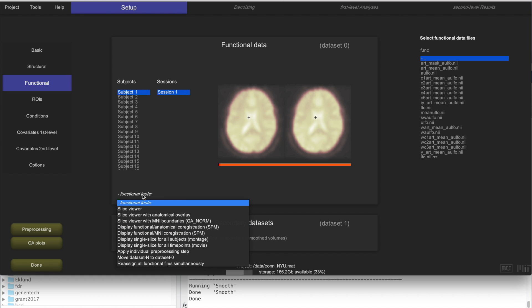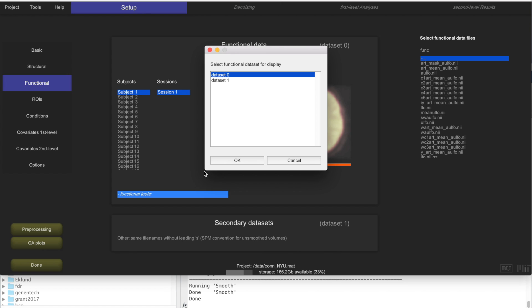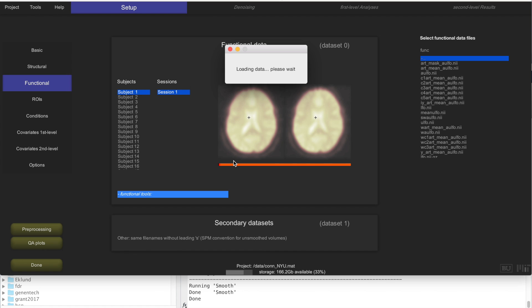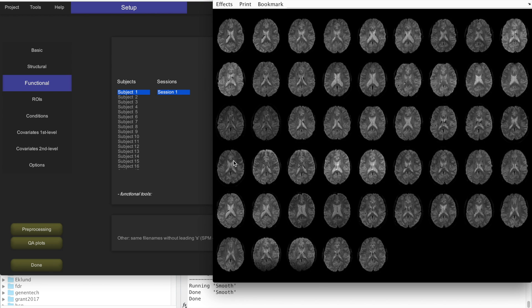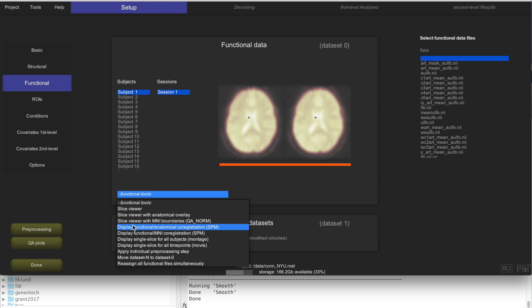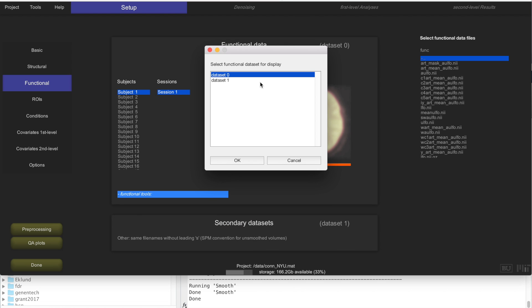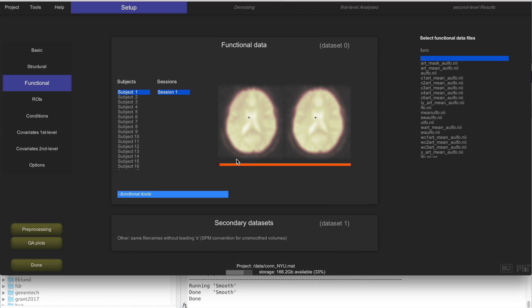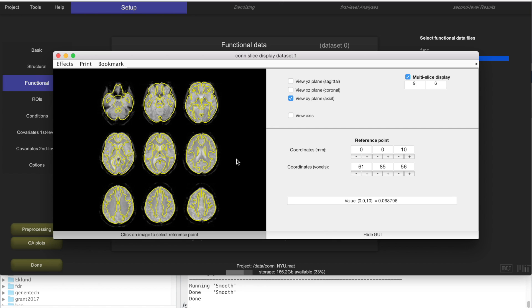If preprocessing works fine, then the data should be in MNI space. When we display a single slice for all subjects, we should be seeing what appears to be actually the same slice across multiple subjects, because the different planes are in the same spatial location. Another way to evaluate this is to look at the functional tool and select the slice viewer with MNI boundaries, then select dataset 1 to display the unsmoothed functional data.